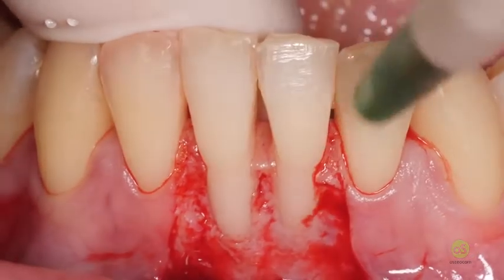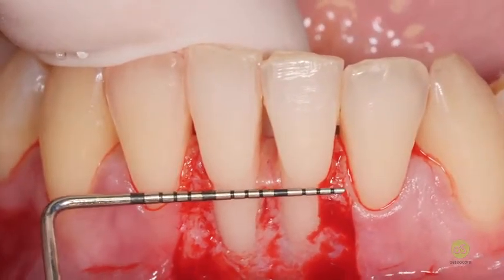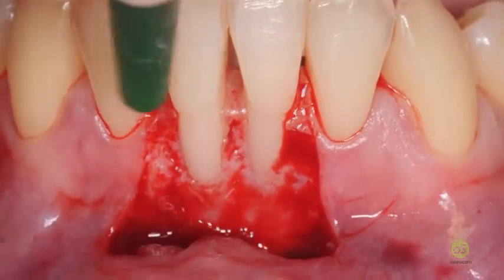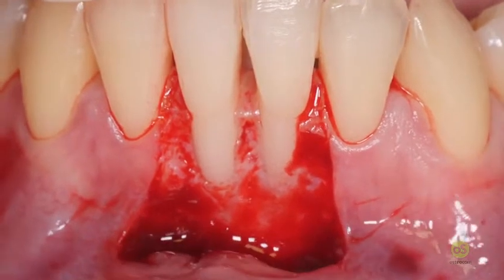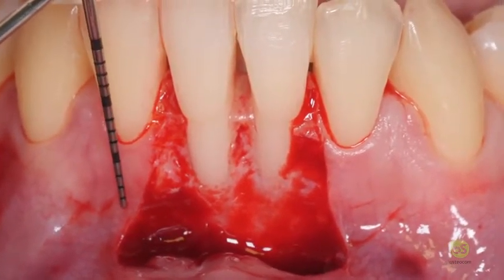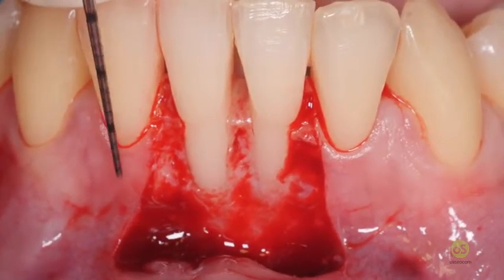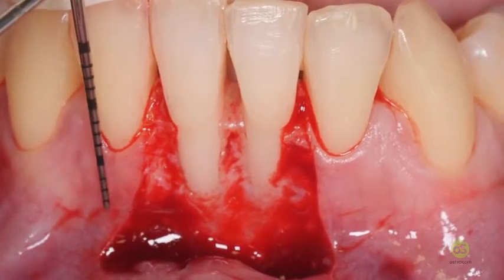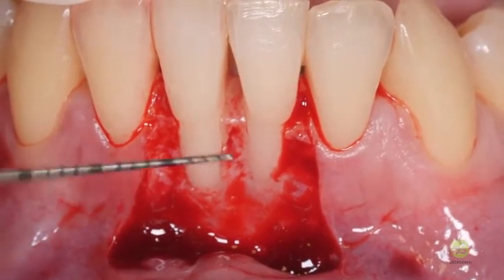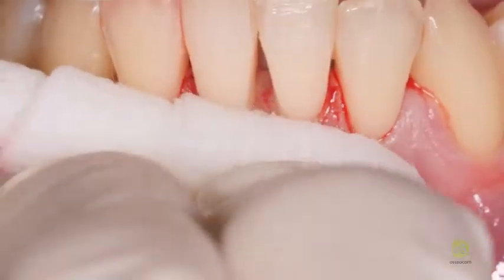Okay, now it's time for measuring the graft from the mesial to the distal recession. We have about 12-13 millimeters, while the apical dimension of the graft, and this is another difference, is in relation to the vestibulum depth of the adjacent teeth, not 4 millimeters, but depends on the vestibulum depth of the adjacent teeth, which is 5. So we will take 13 by 5.